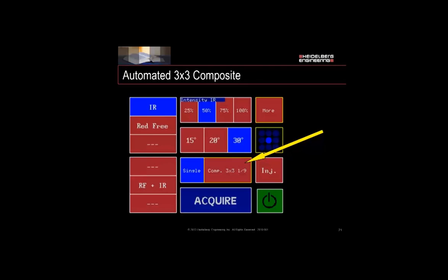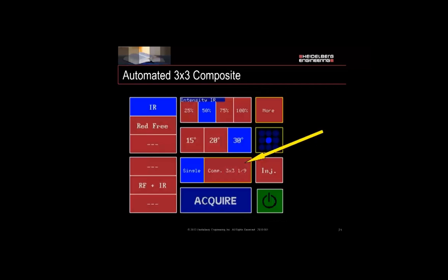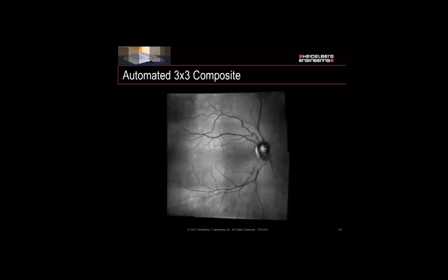For the automated three-by-three on your touch panel, when you turn it on, click the button next to the single image. For most systems that do angiography, it might say Movie Max — click on it and click again. A tip: anything on the touch panel with a yellow outline, like around the More button or the fixation grid, means there's more behind there. You'll click where it says Composite, three-by-three, behind Movie Max. When you do that, it's actually going to move the internal fixation light to all nine positions — just line up your image, take the image, and it'll automatically stitch it together.